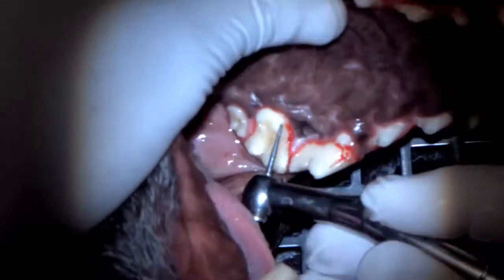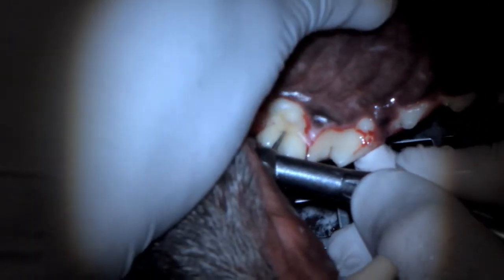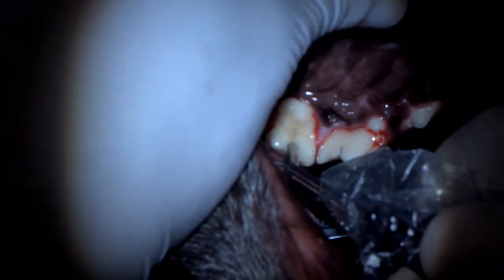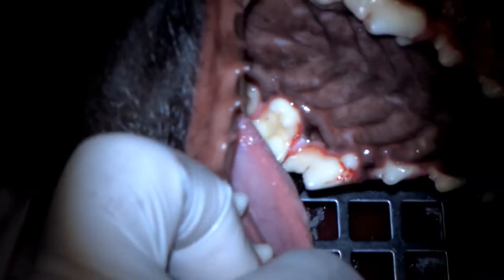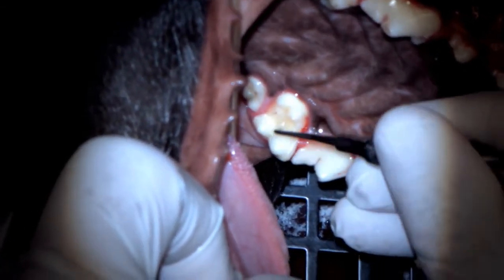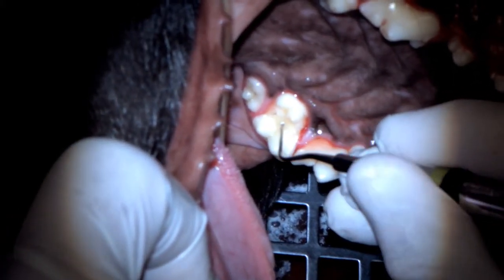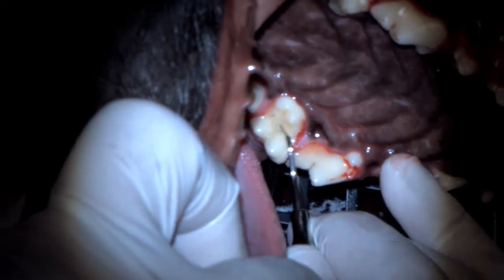So we're going to drill and fill, starting with a number 2 round burr. This defect seems pretty shallow actually. You can see a white line in the round hole — that groove may extend a little deeper, so I'm going to drill a bit more of that out.